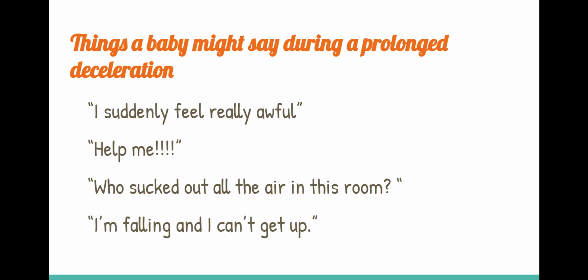So, things a baby might say during a prolonged deceleration: I suddenly feel really awful. Help me. Who sucked out all the air in this room? I'm falling and I can't get up.